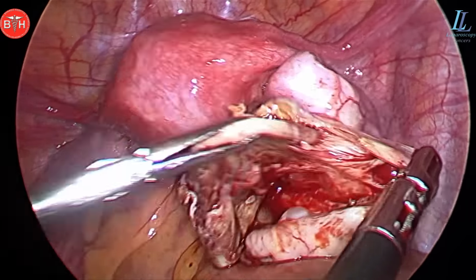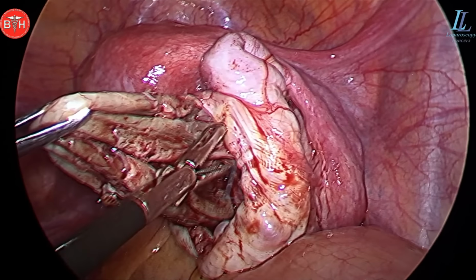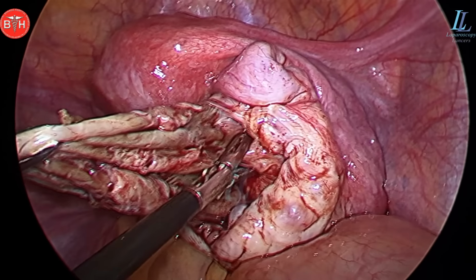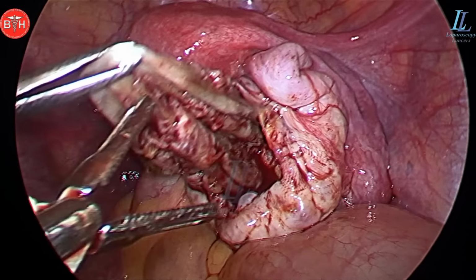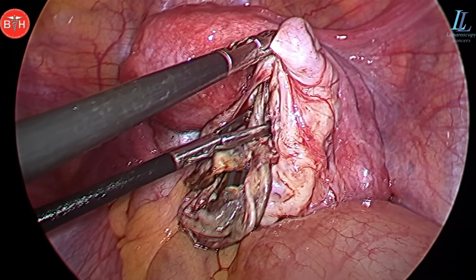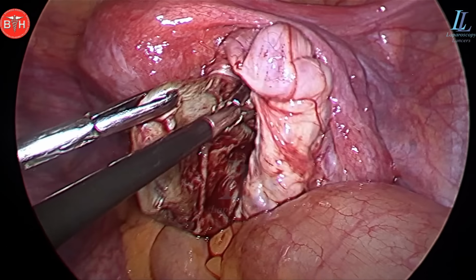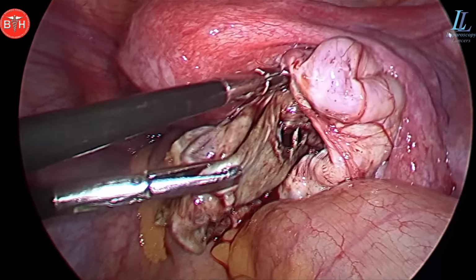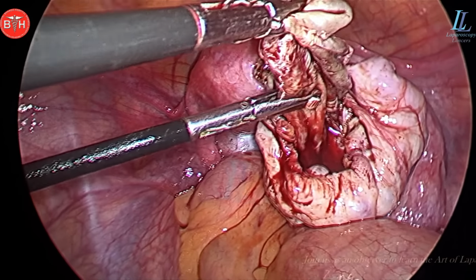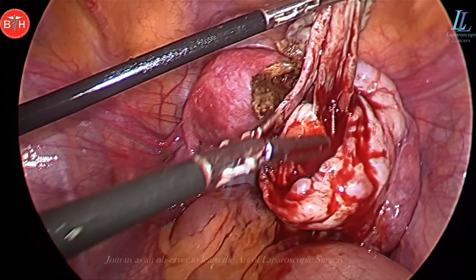They go across the peritoneum and cause severe adhesions and pain, and the pain is typically at the time of menstruation, but when it is deep and causes adhesions, the adhesions itself cause pain because of the intestinal colics, and the patient can even land up in intestinal obstruction. And in stage 4 endometriosis, the ovaries are typically involved, and this is theoretically a stage 4 endometriosis, but a stage 4 endometriosis may not be that symptomatic because it is a contained thing, but theoretically this means a stage 4 endometriosis.